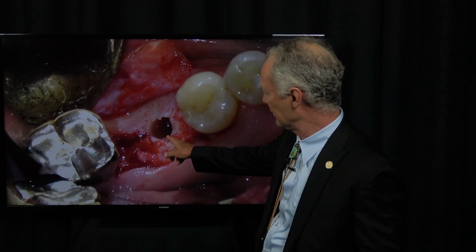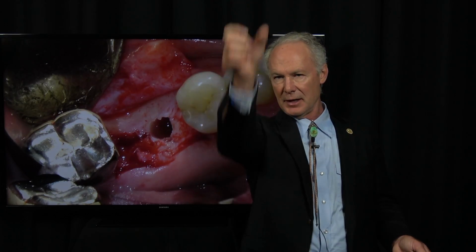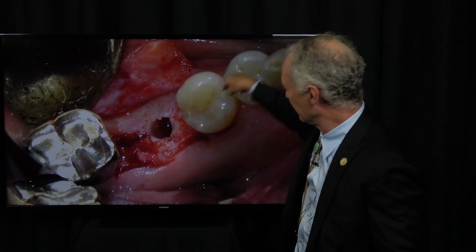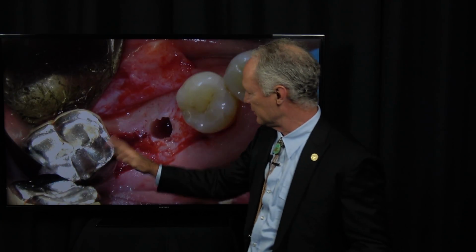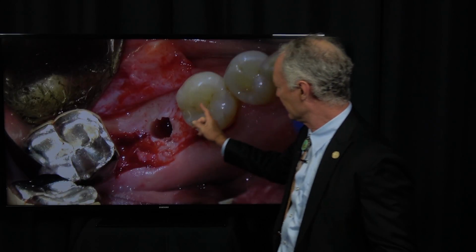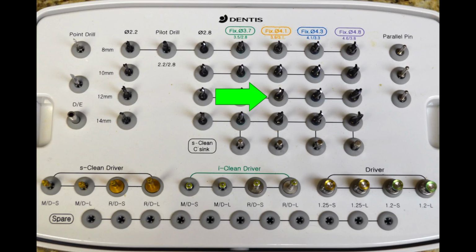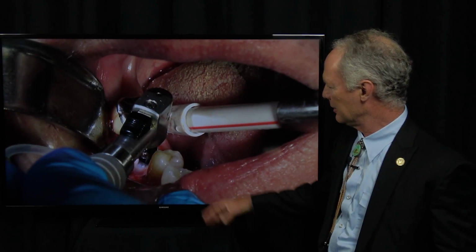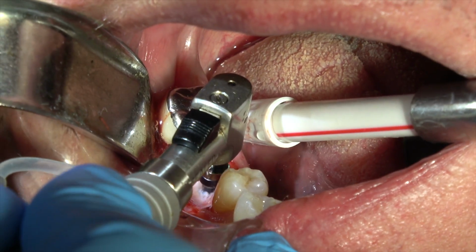And then I'll leave the drill in the osteotomy and just look at the top part of the drill and be sure it's in the same long axis as this tooth or this tooth. Now this tooth is tipped a little forward, so I'm mainly going with the second bicuspid. Now remember, I'm able to use these wider drills because I've got a wider alveolar crest.